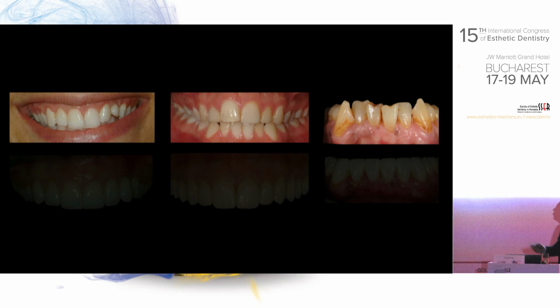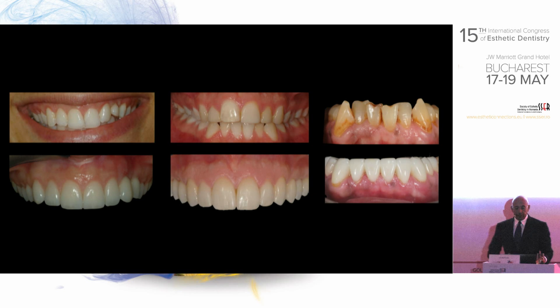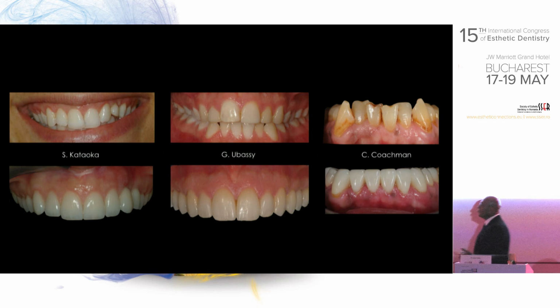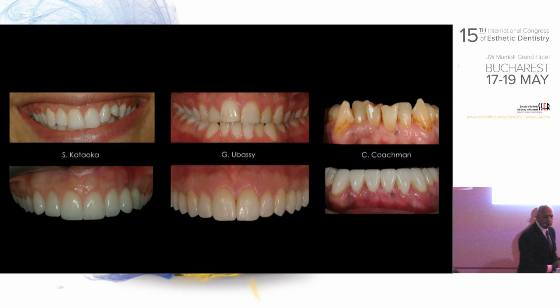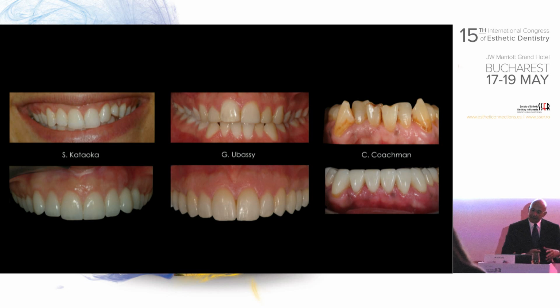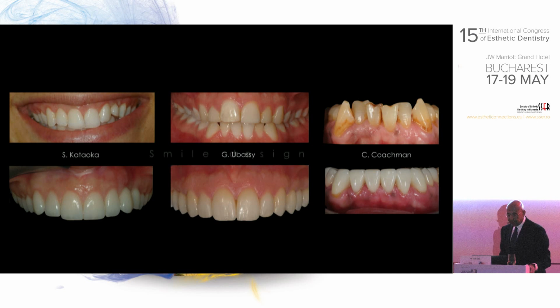And in order to get this kind of result, all of them belonging to the before cases above on the screen, we definitely know that we will need an interdisciplinary approach. We worked in those cases with 3 different ceramists, Kataoka, Ubasi in this case, and Christian on this one on your right. It definitely needs, first of all, to define your smile design and a very interactive communication so that you can run the whole thing smoothly.